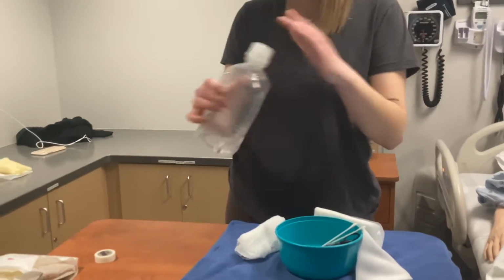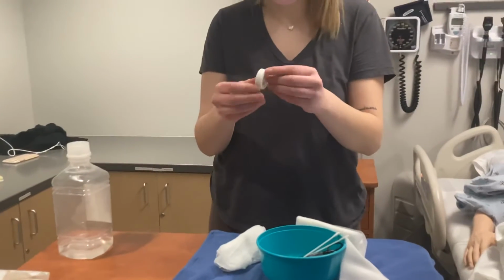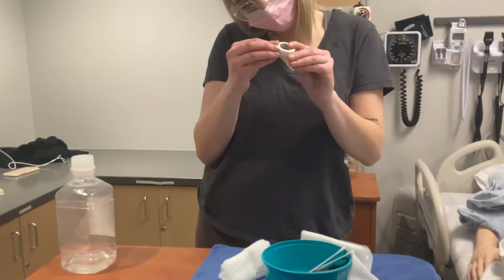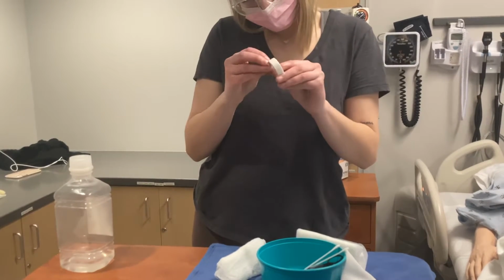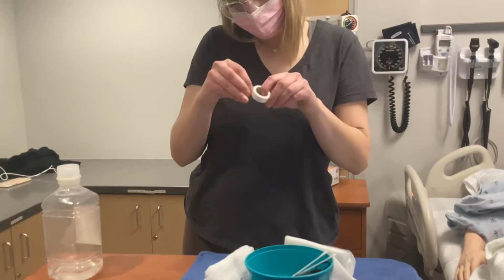All right, now at this time I'll get the tape ready before I apply my surgical gloves so it's easier. Almost got it.